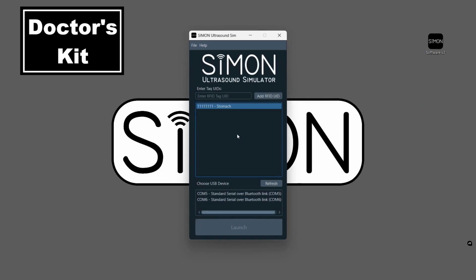However, it is very important that you keep track of where each tag is located on the patient model. In other words, if you are uploading videos of the stomach to tag number 1, then you need to make sure that tag number 1 was placed in the correct location on your patient model. Keep in mind that these instructions apply to any sort of patient model and not just a dog.